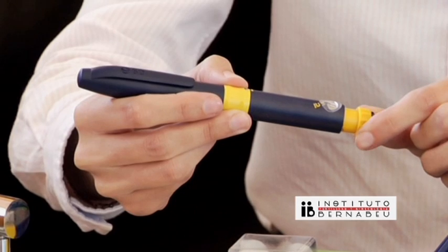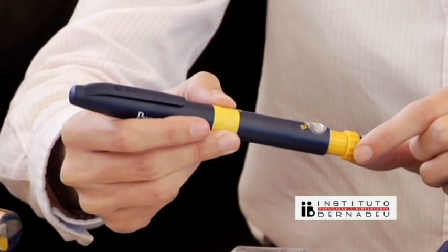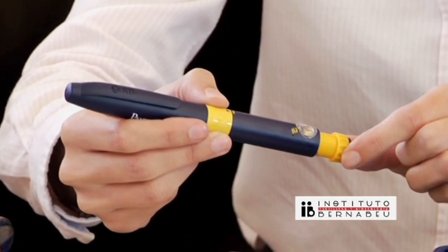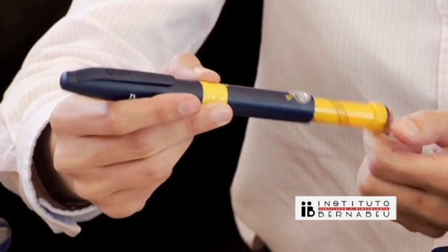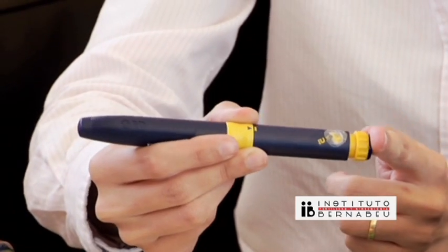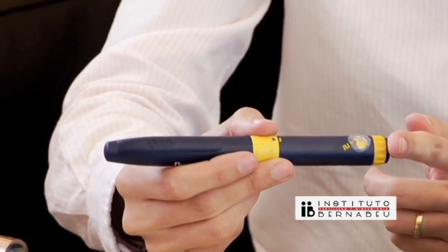It is a dial that allows you to choose the exact amount of units needed. If, for whatever reason, you select too many units, simply dial forward as far as it can go and push the injection button in completely. This is so you don't lose any medication.